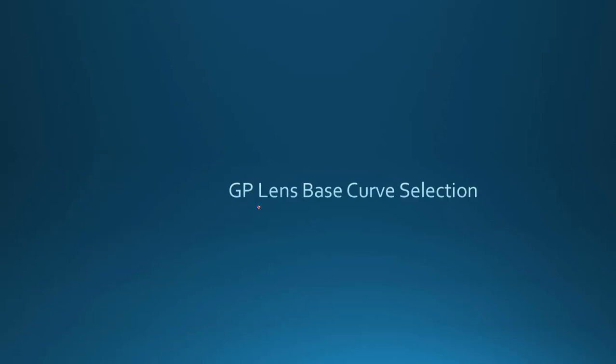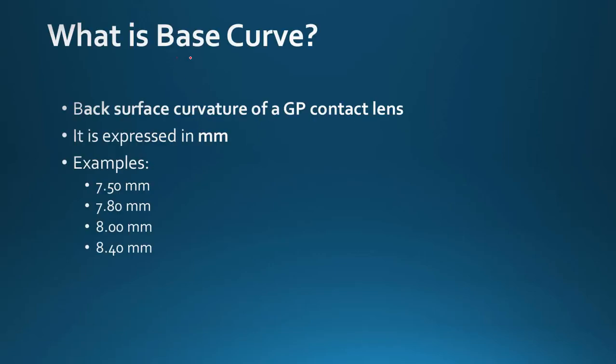Next we have GP lens base curve selection. We will understand how to select the initial base curve for the GP lens. Before going forward, first we need to understand what is base curve. Base curve is basically the back surface curvature of a GP lens.